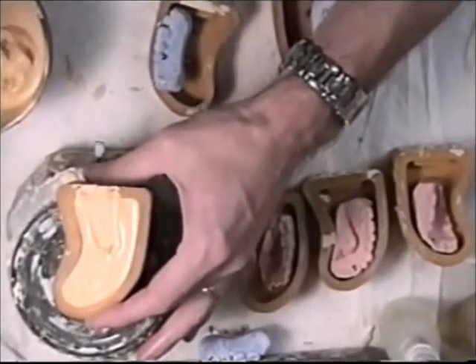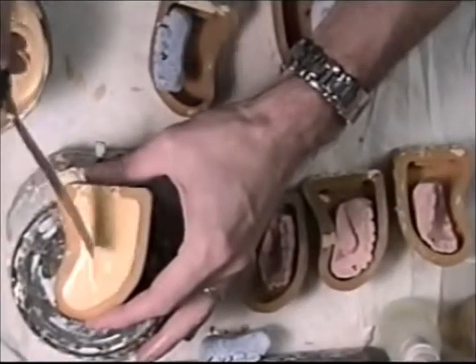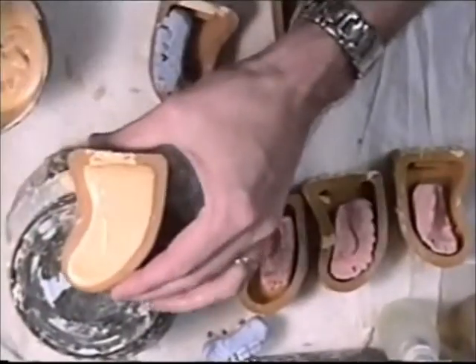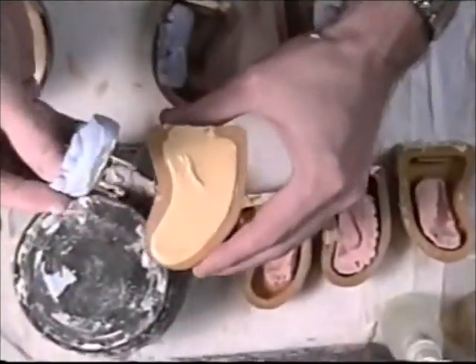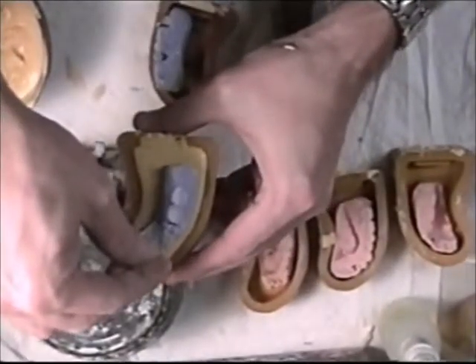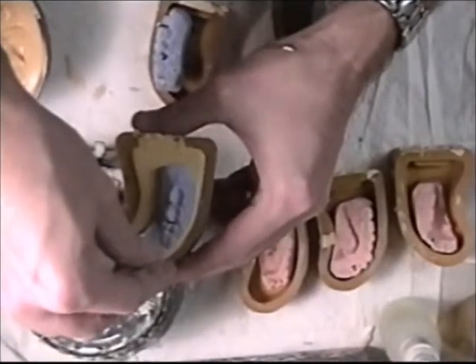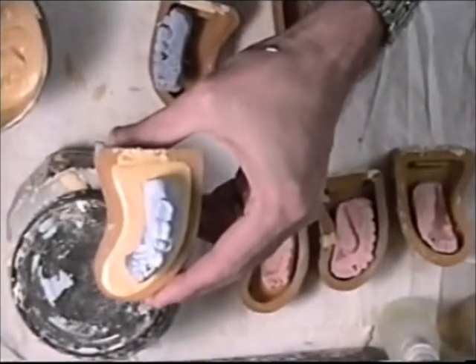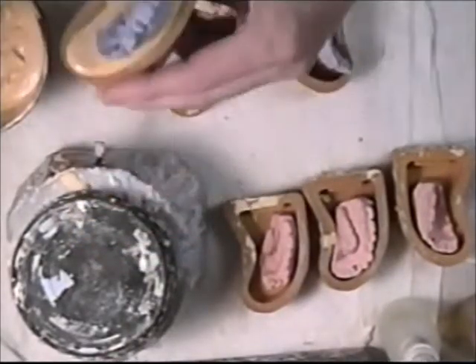Pour it level to the top. Then I take the die model and just sit it right onto the lab stone, making sure that it doesn't go to one side or the other. Just set it somewhere on a bench where it will not be disturbed.